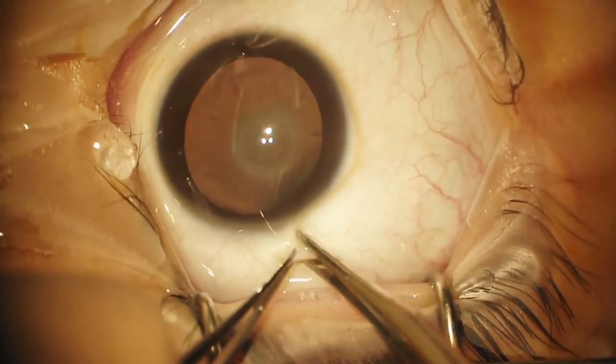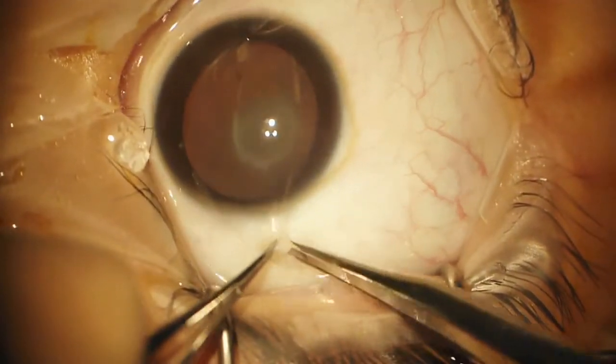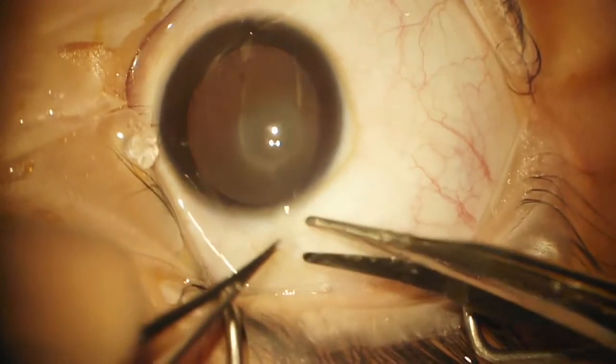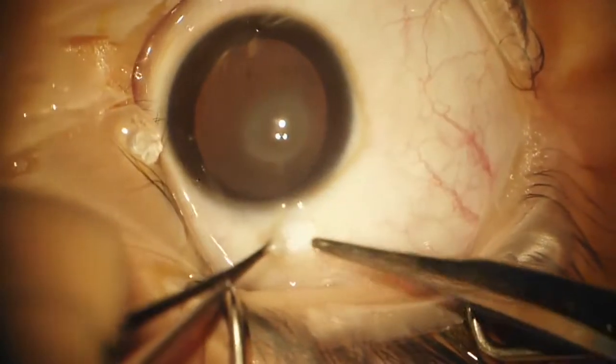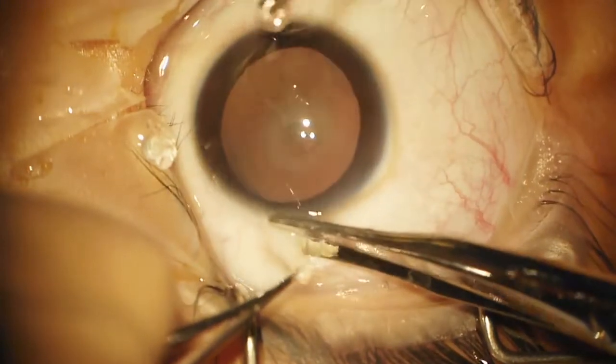This is a seven-year-old young man with a history of congenital cataracts. You can probably see very clearly that he has a very dense posterior capsular cataract, and this likely represents a posterior polar cataract. His vision is poor.